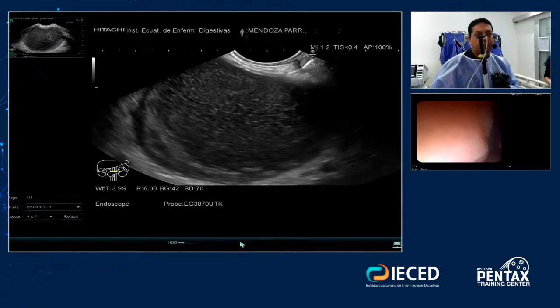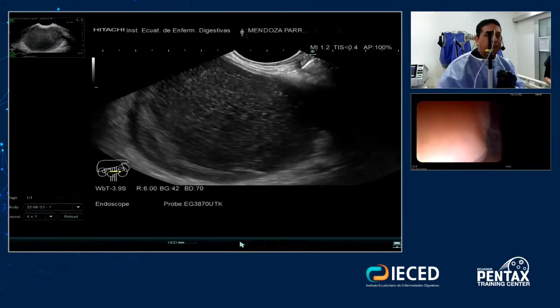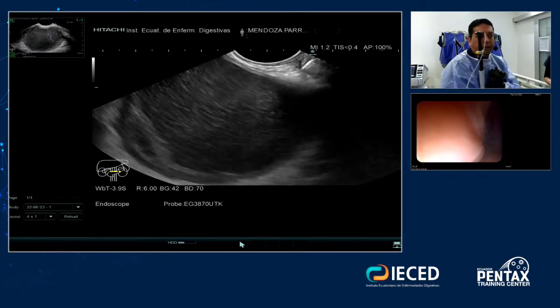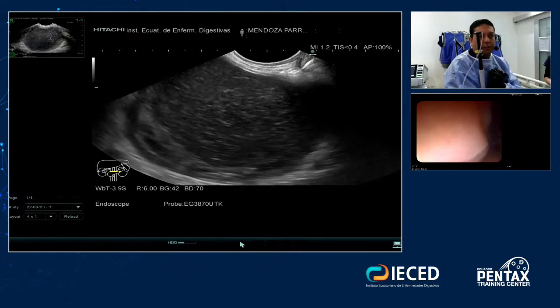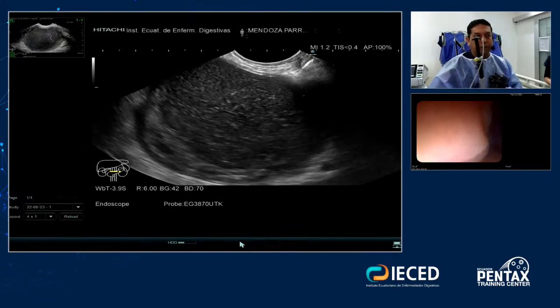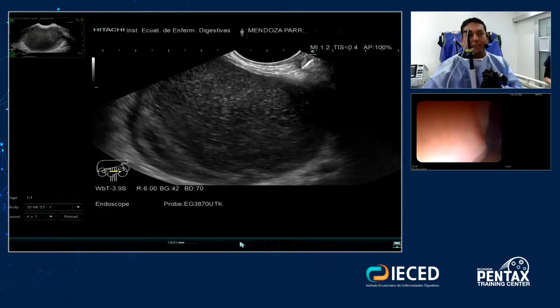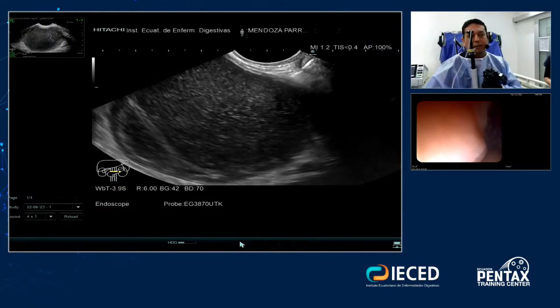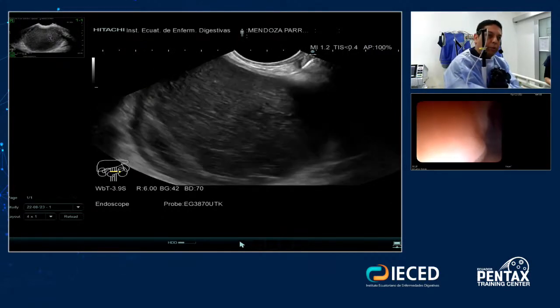In some series, some bleeding can appear, but it is very important to see on the CT scan if there is any kind of aneurysm or something like that. In those cases, you can use a plastic stent inside the Axios, for example, the LAMS that you will use. So today I will use a hot Axios.